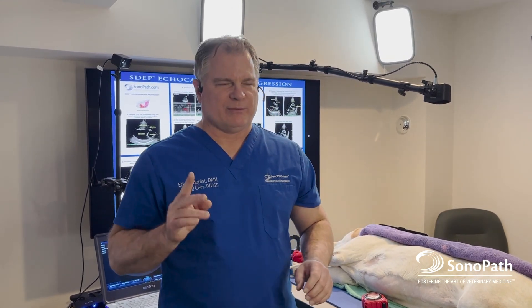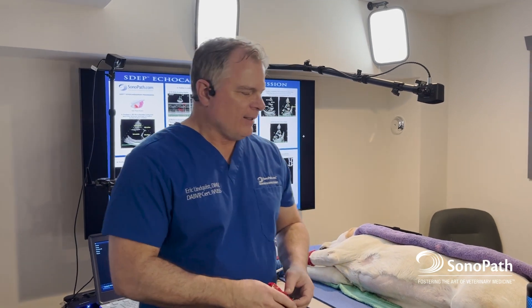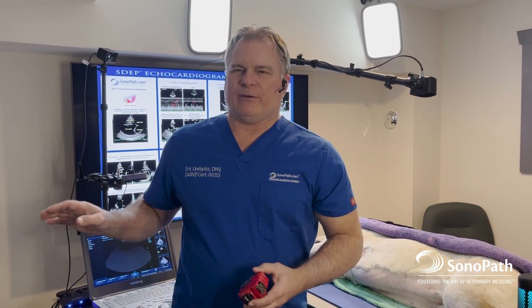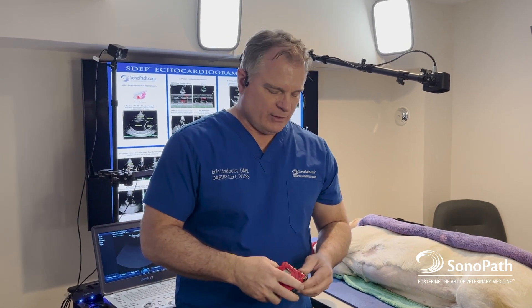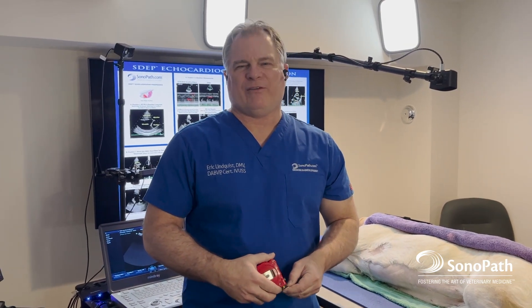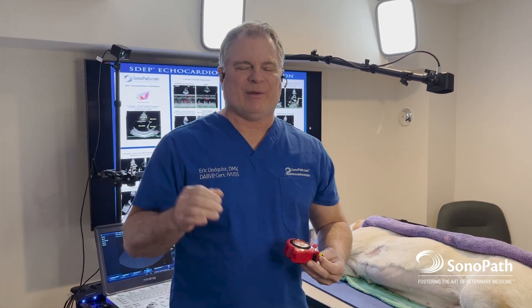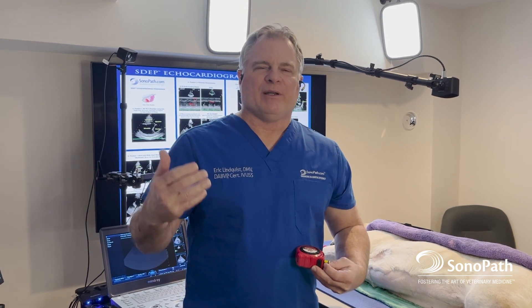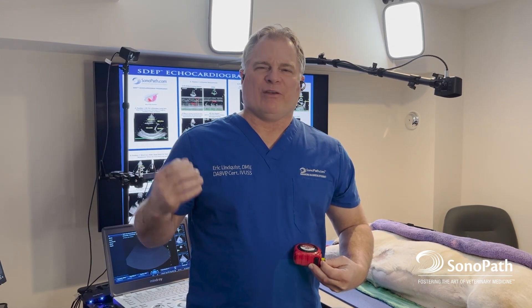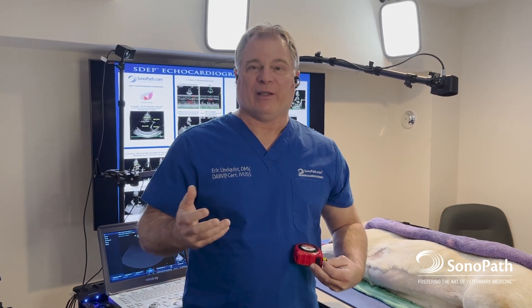We're going to start with a simple scenario that you can do when testing your machine, whichever machine you're looking at. The depth on ultrasound machines is measured in centimeters, so I'm going to convert to inches — 3 centimeters is a little over an inch. When I talk about image quality, I'm talking about the depth shown on your screen, because the resolution is only diagnostic in the first 3 to 4 centimeters in the really cheap machines.